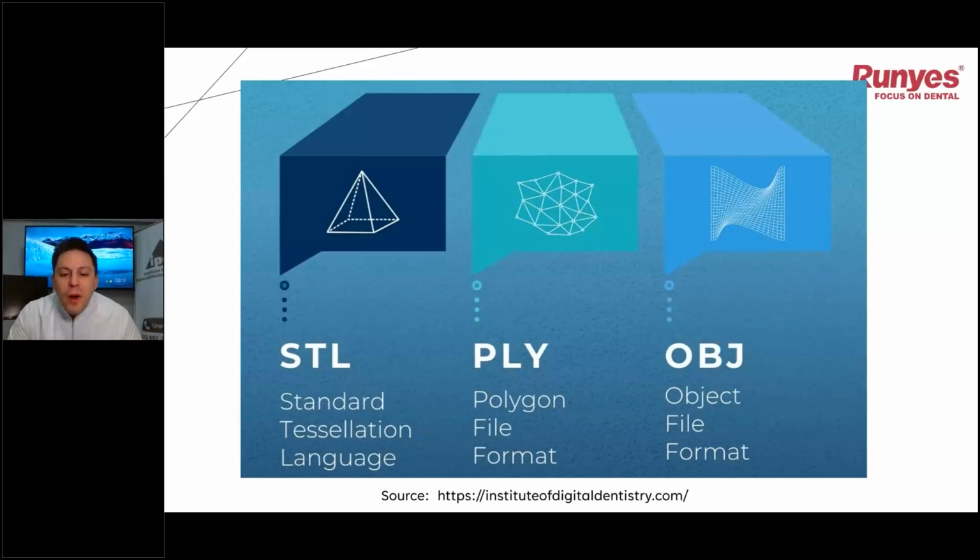The STL file, which is standard tessellation language, is the most common file in digital dentistry. It has no color, but it is the most common and most accepted one for the majority of the software that works with digital dentistry.